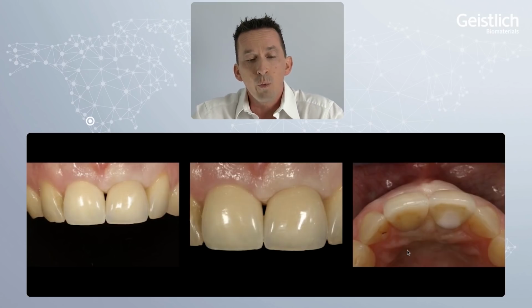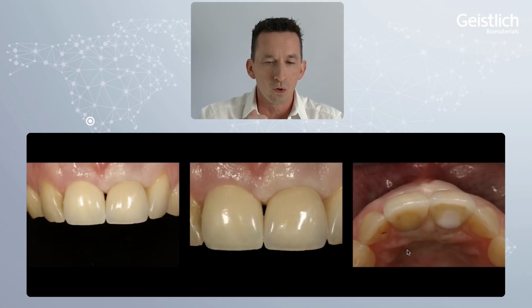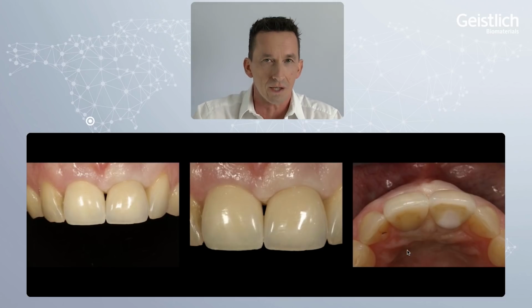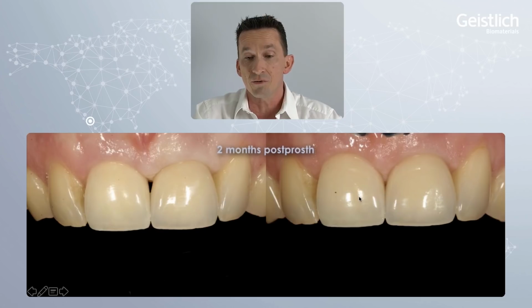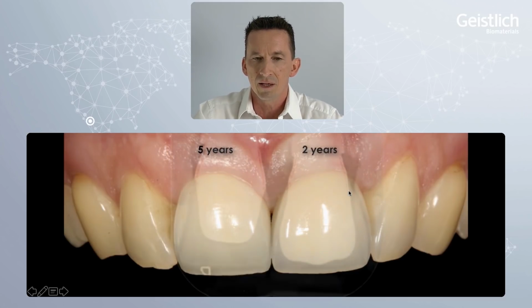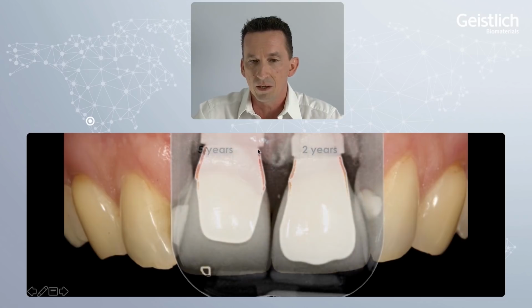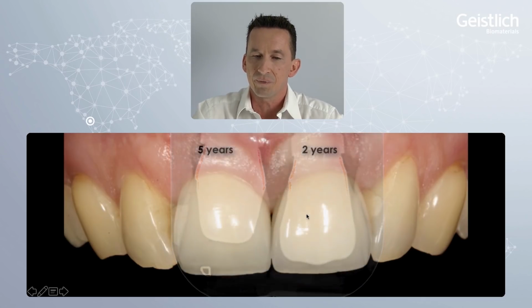What happens when we disturb soft tissue? We're going to lose tissue during treatment. But we know from the literature, if you don't touch soft tissue anymore, you get that papilla back. That's 2 months post-prosthetic treatment, 2 final crowns, and almost a full papilla. This is after 5 and after 2 years. This now is the X-ray, which shows you the bony support between implants, which are closer than 3 millimeters in distance.